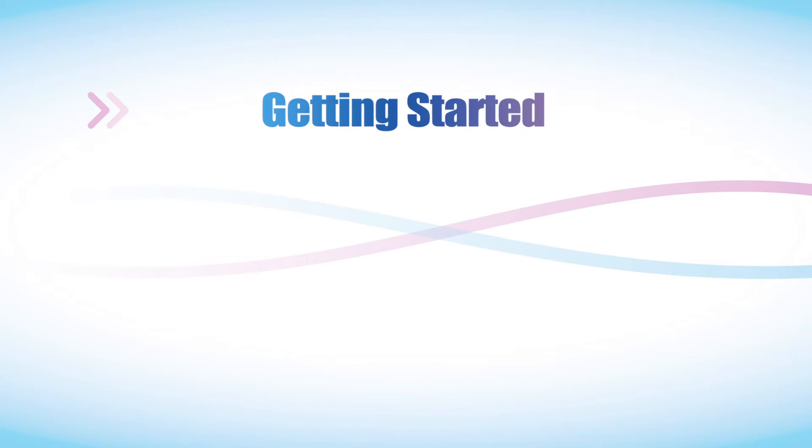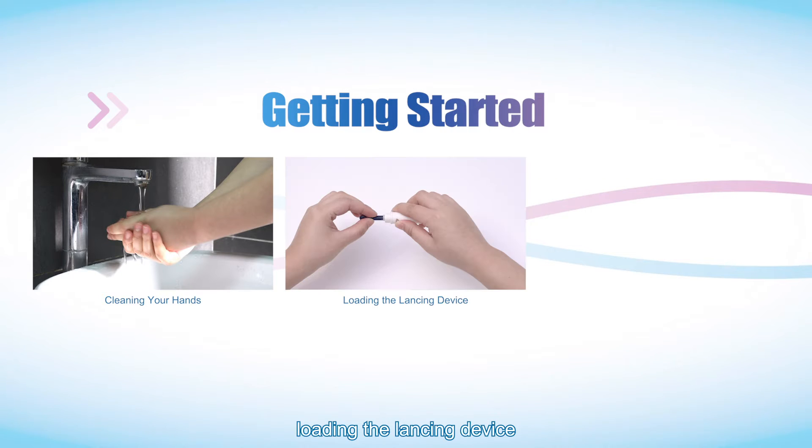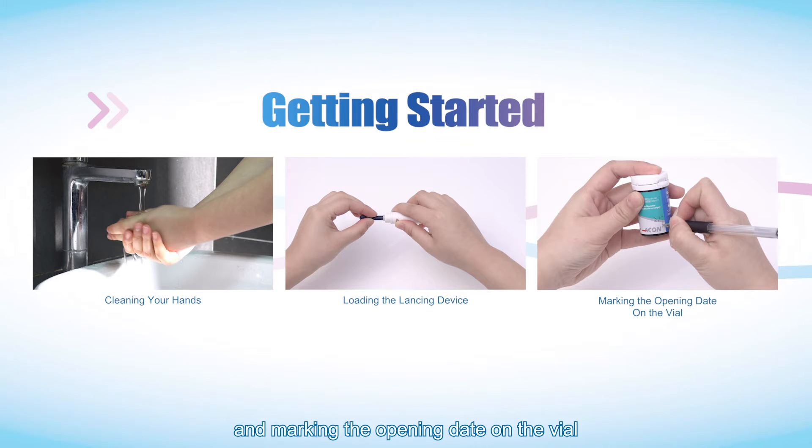Getting started. Clean your hands, load the lancing device, and mark the opening date on the vial.